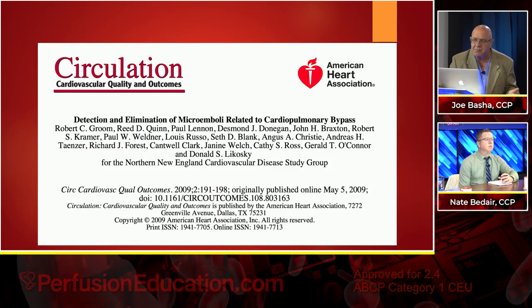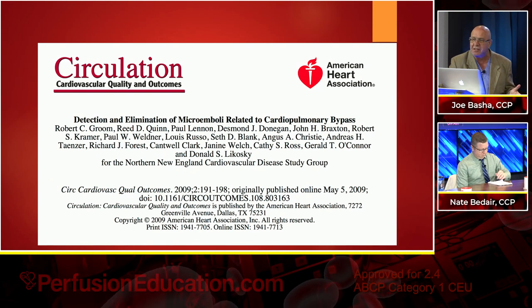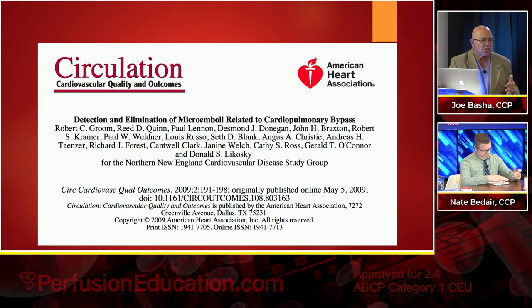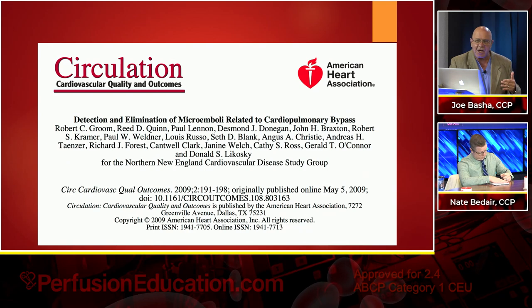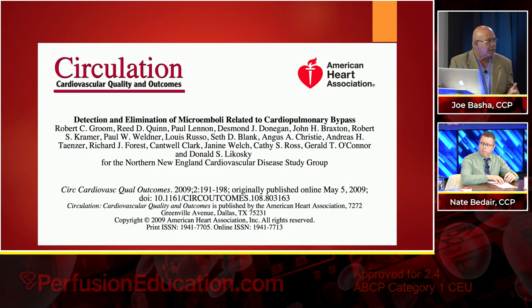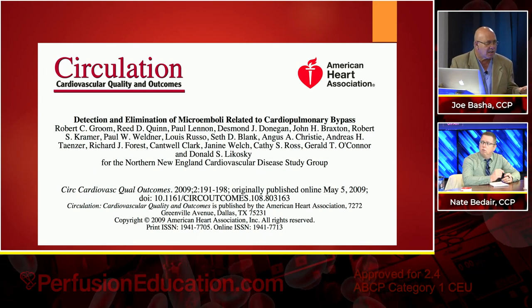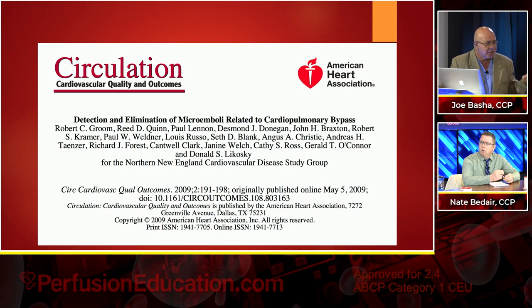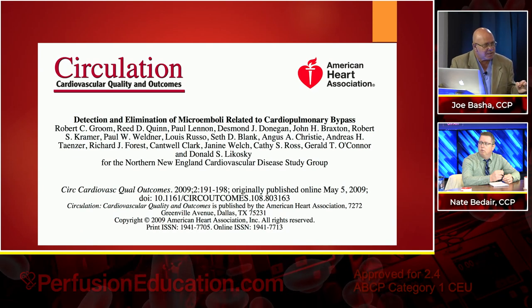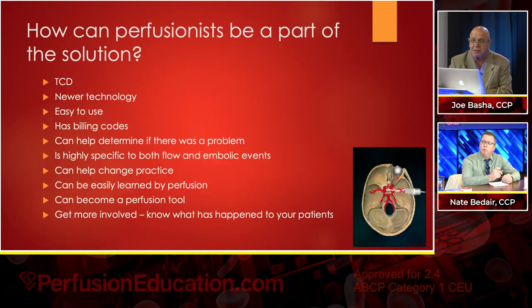Bob Groom, and I've talked about this before, had been talking about cerebral oximetry for a very long time. This was written up in 2009, so 11 years ago, and even before that he was talking about it. But he was showing how TCD worked, and they would change things on the pump. He would give medication, and they would see a bump up in the TCD, in the embolic events. He would tap the line, and that wasn't artifact, because you can tell artifact from that. You would see a shower of embolic material, probably air that was hung up in connectors. There was something somewhere. So he's been advocating the use of TCD for many, many years.